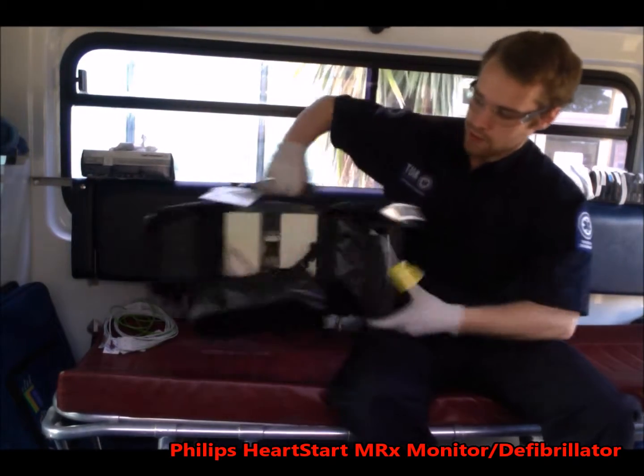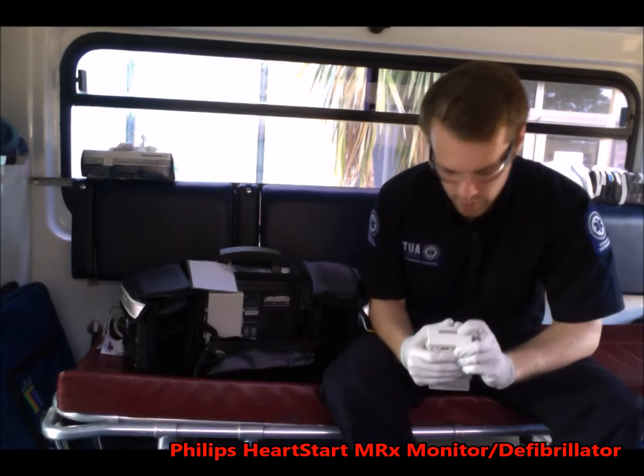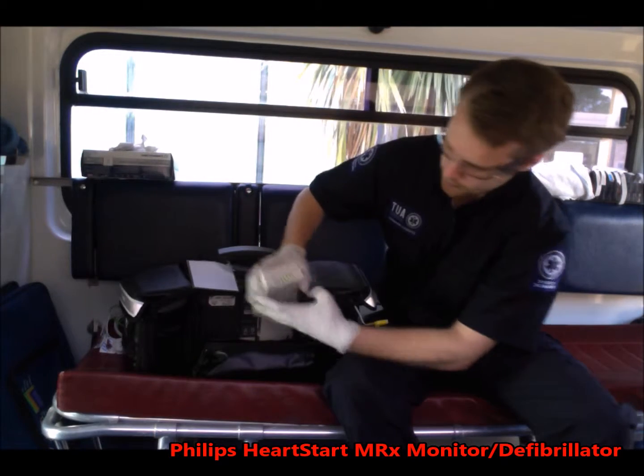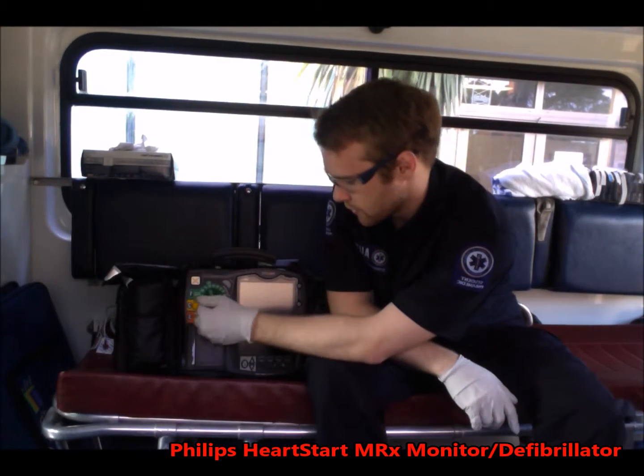So to do this, you turn around and we have 2 battery packs right here. You pull them out and then you press the button on top and you can see that this is a full battery. Next we want to place the defibrillator in manual mode, so we just turn it on.